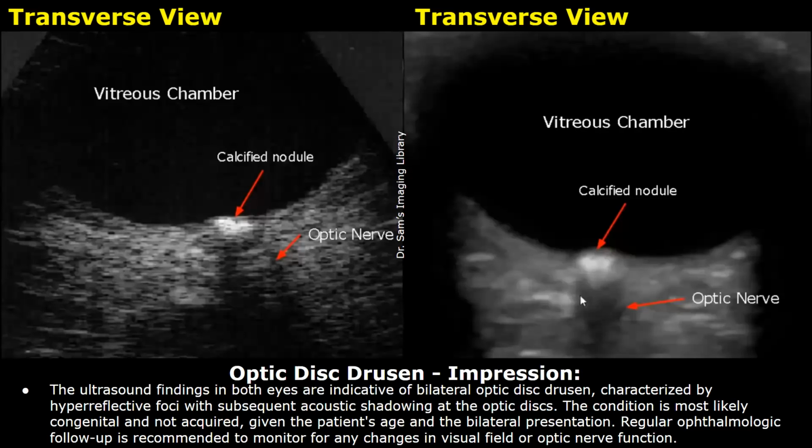The condition is most likely congenital and not acquired, given the patient's age and bilateral presentation. Regular ophthalmologic follow-up is recommended to monitor for any changes in visual field or optic nerve function.